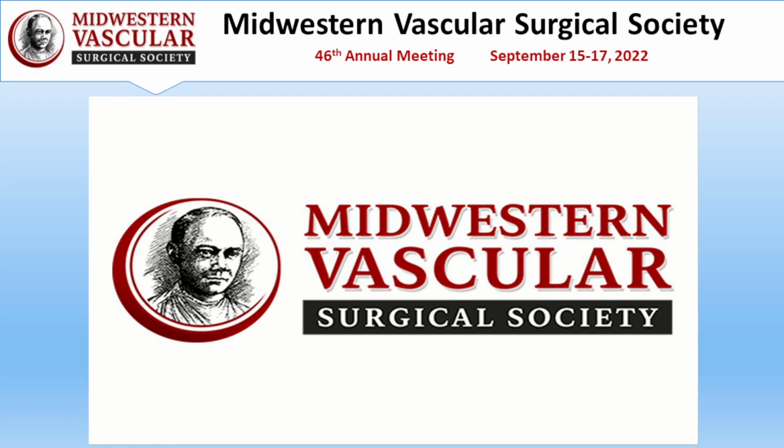So, I mean, there are a couple of things to weigh based on this. One is the distal extent of the aneurysm, how far up it extends. With this one being up near C1, it was more in the C2 region. That's why we elected to take an endovascular approach. But the question of durability and long-term outcome of the stent, and having to go back and do something, would also be something to weigh against that.